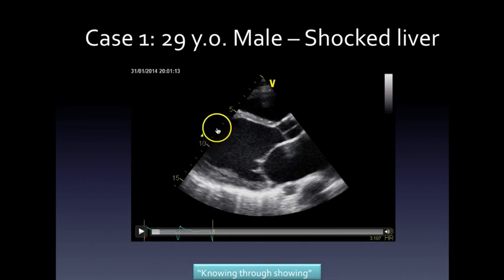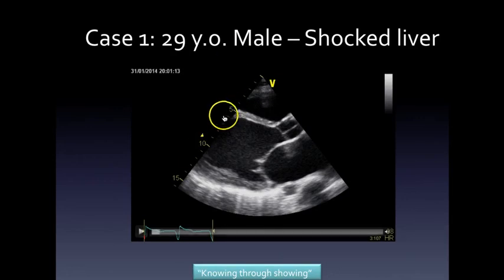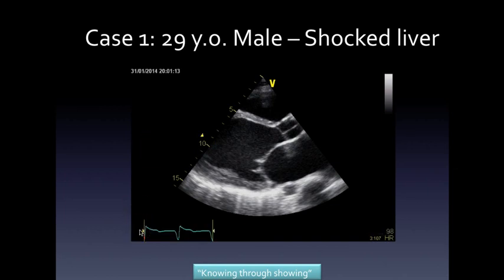So the depth setting on the echo machine will determine what the measurements are. So if we hadn't 5, 6, 7, 8, 9, 10 on the slide, you couldn't say that the ventricle is dilated or not, because you've nothing to measure it from. So you can measure it here. You can see it's somewhere 5, so 1, 2, 3, 4, 5, 6. Yeah, we'll say 7. 7 centimeters, that's big. So this young boy has a big ventricle. He's dilated, first thing. So now, okay, good start there, right?